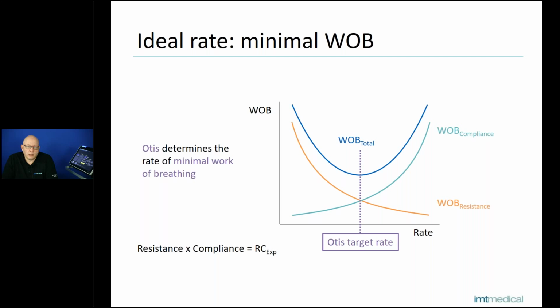He was just looking at how mammals, humans and animals breathe, and he found out that they're always looking for the best point and the least work of breathing to be comfortable. Of course this changes when the lung conditions change. If the patient gets ill, breathing gets more exhausting and will not be so easy when you have a restrictive or obstructive problem.